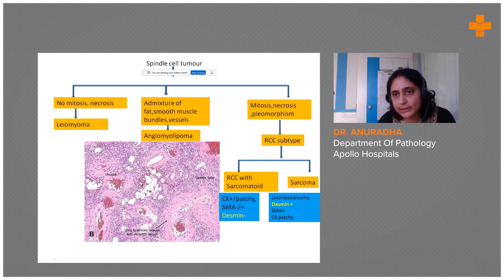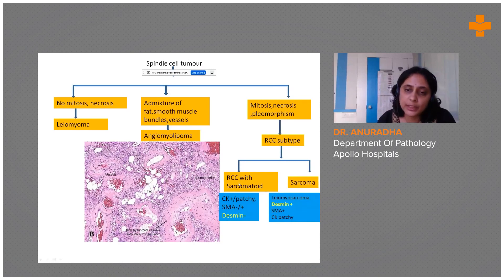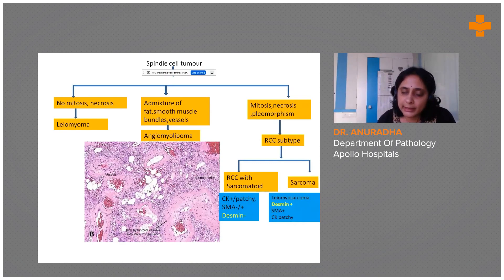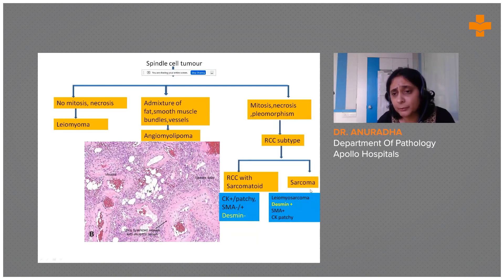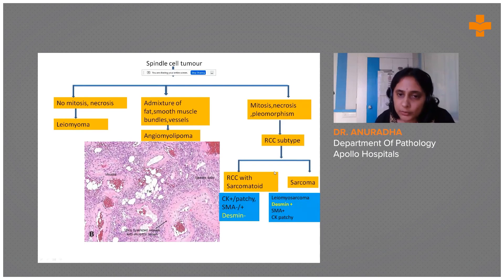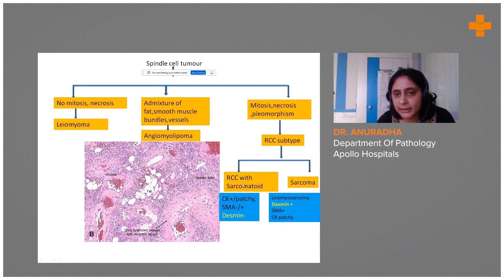If it has a sarcomatous look with a lot of mitosis, necrosis, and pleomorphism, please look for an RCC subtype. If you can identify an RCC subtype, call it under that particular category with a sarcomatoid change. If you are finding mainly a sarcomatous component, you need to exclude all the sarcomas listed earlier.